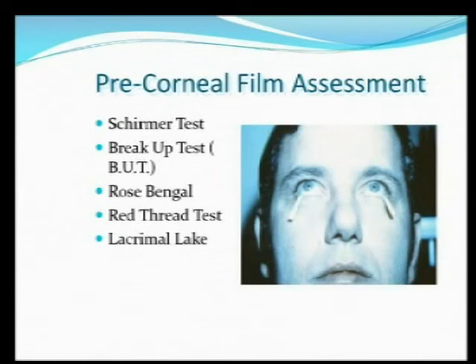Now, if you do the test without the topical anesthetic, you can be pretty sure the whole strip's going to be dripping at the end of 5 minutes. Most people don't do well when you stick a piece of paper in their eye. So anyways, that's the Schirmer test, even though as optician contact lens fitters, it's not a test that we typically use. A far better test is what's known as the tear breakup test.